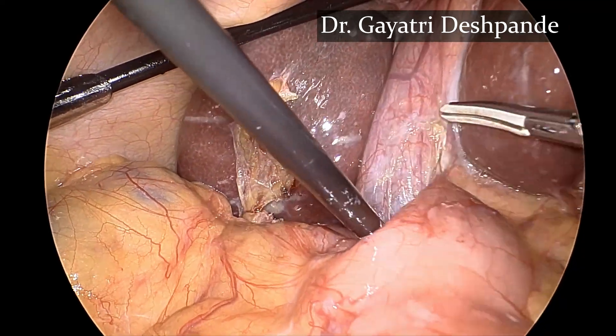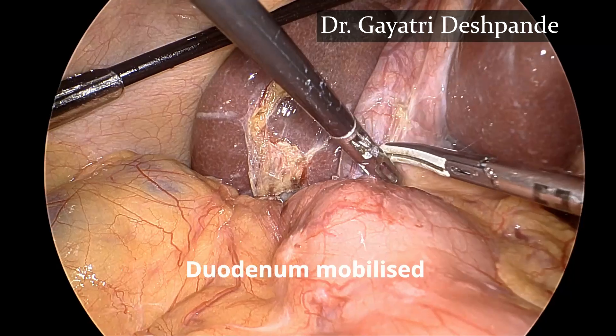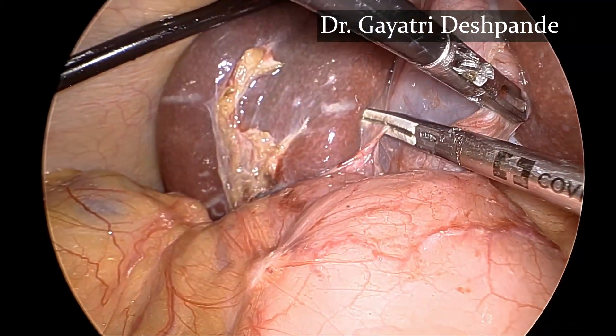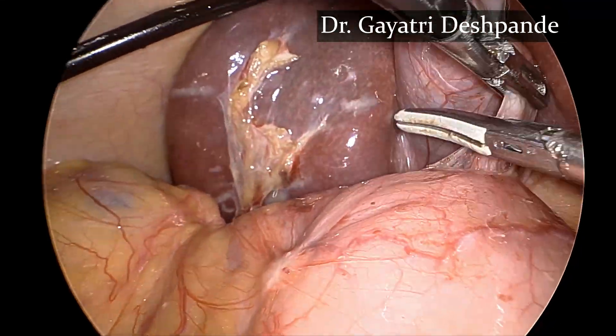The duodenum is completely mobilized using the energy source. The other adhesions are also cleared so as to get a clear view of the anatomy and the gallbladder region.